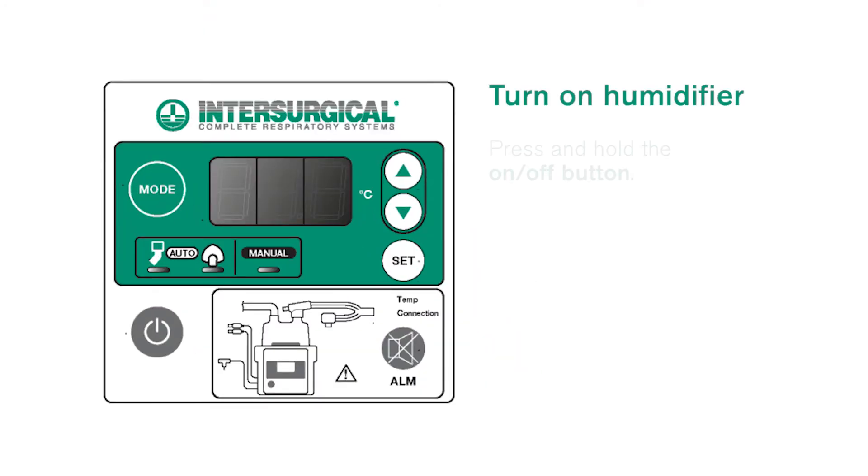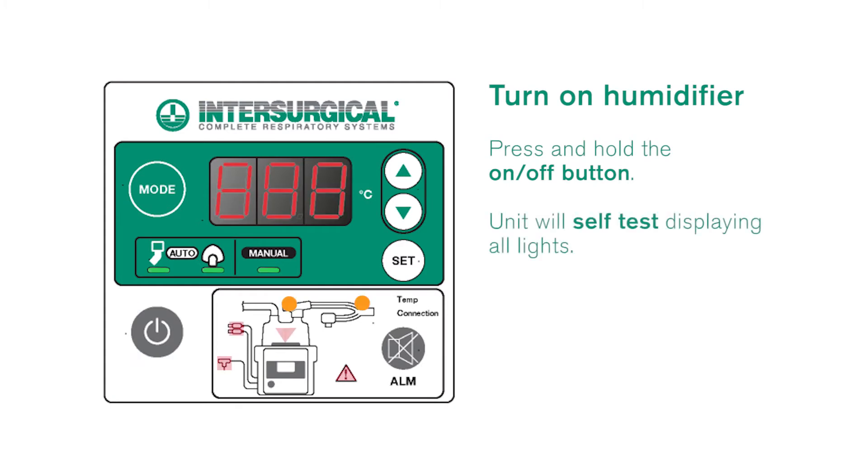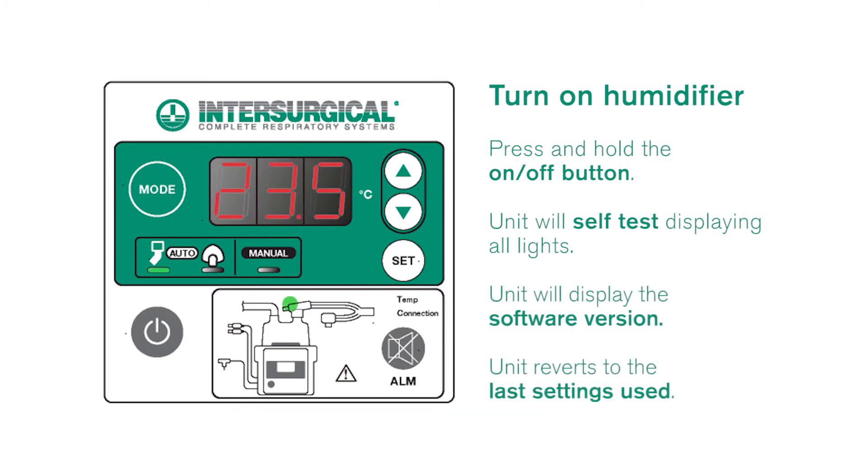Turn the humidifier on by briefly holding the on/off button. The unit will then self-test displaying all lights. Then it will display the software version. Finally it will revert to the last settings used.